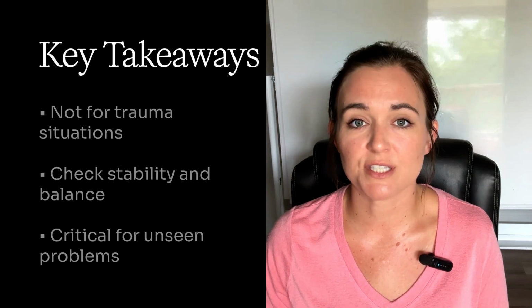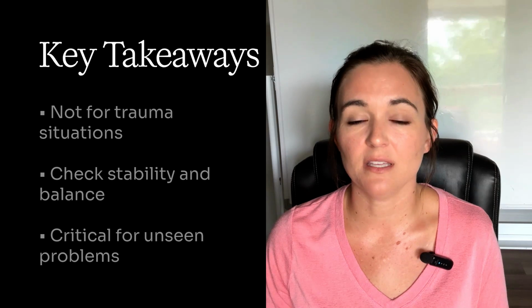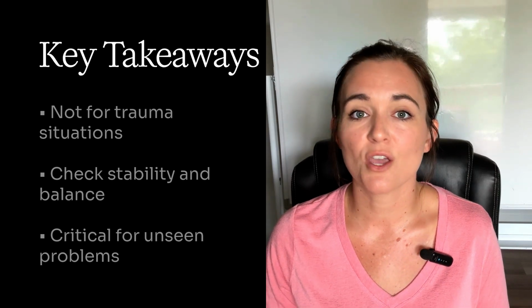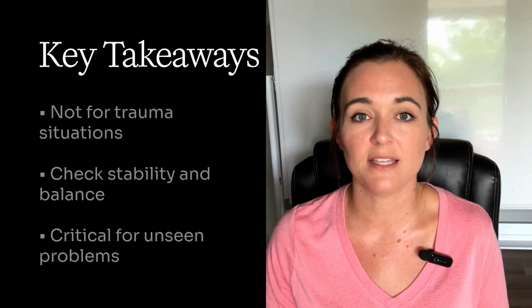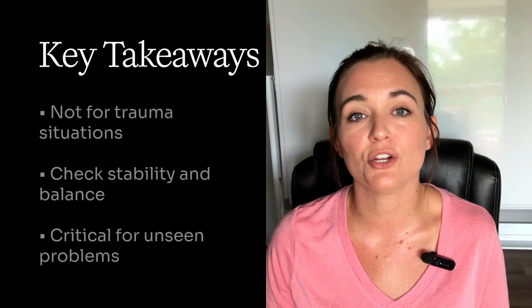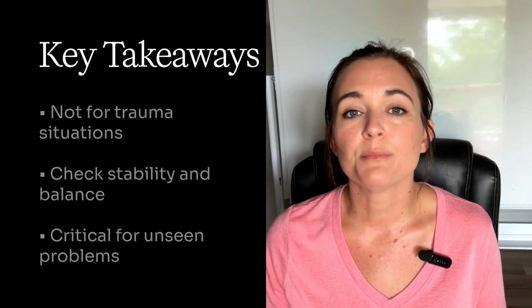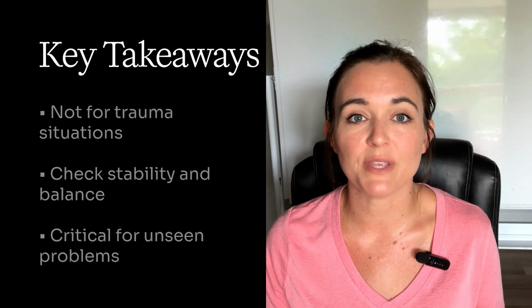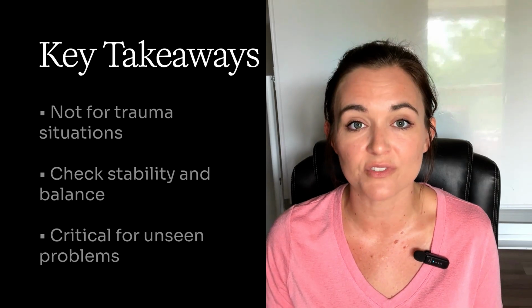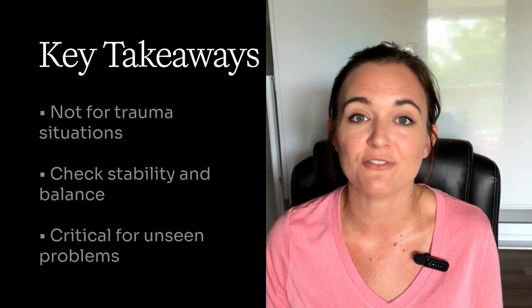Always check the patient's stability, comfort, and balance. Know your anatomy, C1 to T1, spinous processes, posterior alignment lines, and if anything looks off, mark it clearly and alert the radiologist. These motion views may look simple, but they're some of the most valuable tools we have for seeing problems that only show up when the spine moves. And that's exactly what makes them board-worthy and real-life critical.